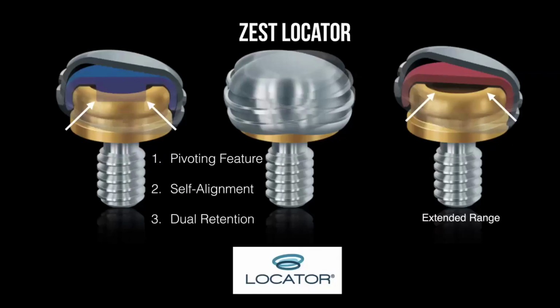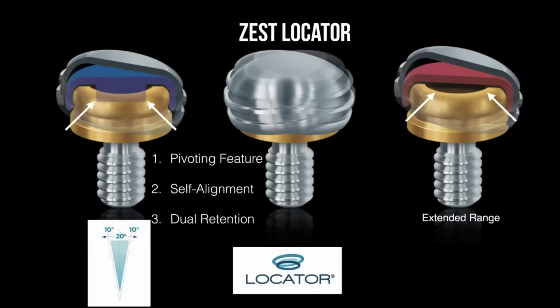One of the very common attachments is the one coming from Zest. They call it Locator, and it has some pivoting motions, and they snap better, they're bigger, and they have a different kind of retention mechanism. Some of them are called regular attachments or dual retention. With dual retention, you get some retention from the plug inside the Locator and from the outside periphery. And they can compensate around 20 degrees if implants are off angle, so 10 on each side.